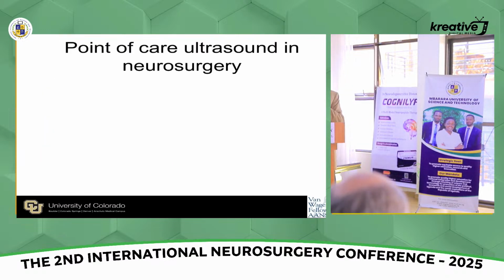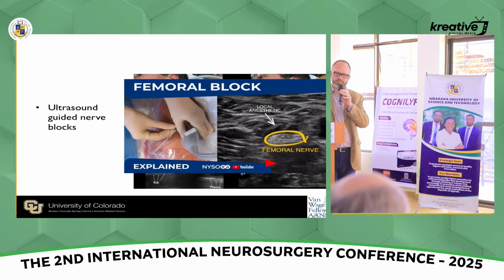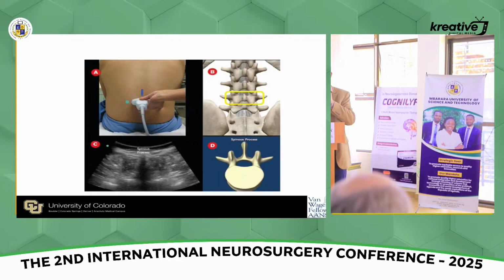If we think of point-of-care ultrasound in the ICU, we can do ultrasound-guided procedures for central lines, IVs, femoral blocks, and other paraspinal blocks. Ultrasound can be used to guide lumbar puncture in settings where the patient just is difficult to get into the intrathecal compartment.